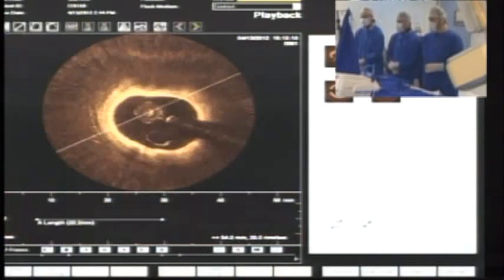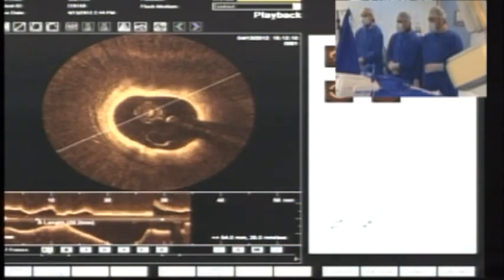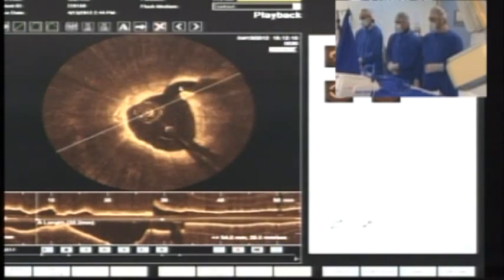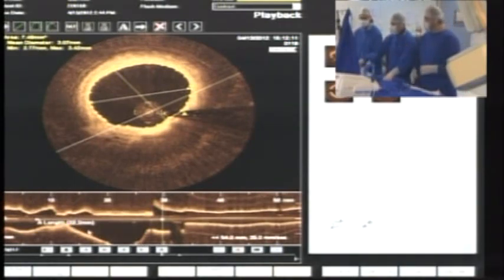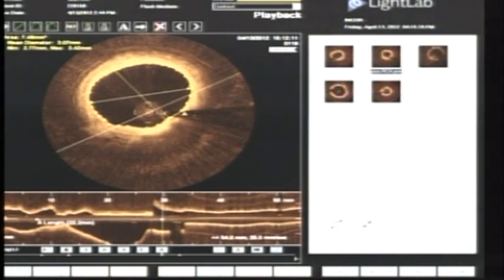We use it as a landmark to calculate. Now with C7, it's extremely easy. It navigates as a short monorail, but there is a cost associated. Would you use OCT? It's easy to use, with beautiful images, but are you more familiar with IVUS perhaps? Yes, we have OCT and we've been using it more and more, but I'm still not able to fathom it as clearly.